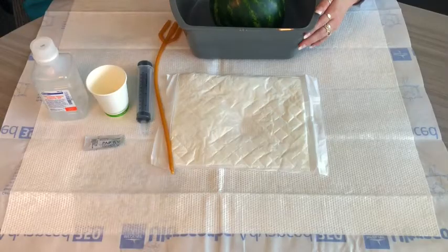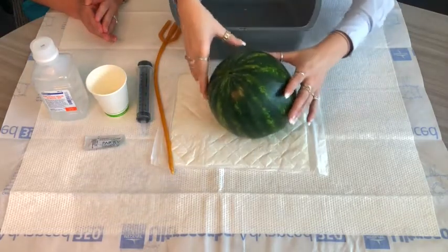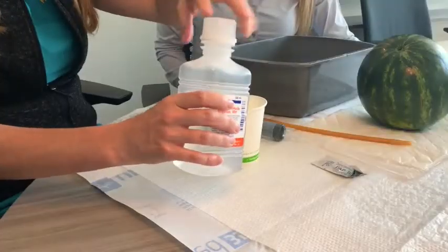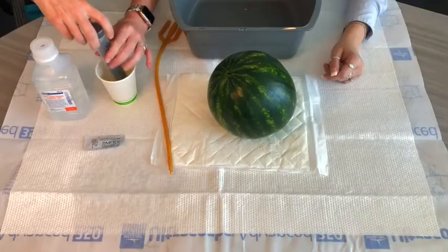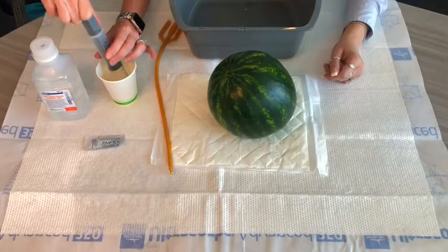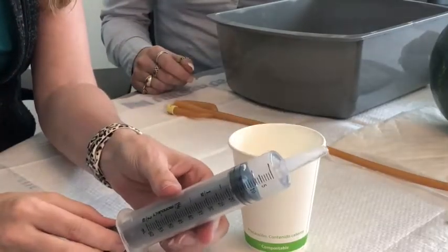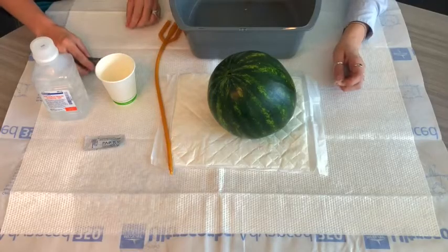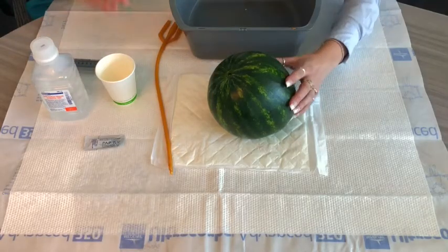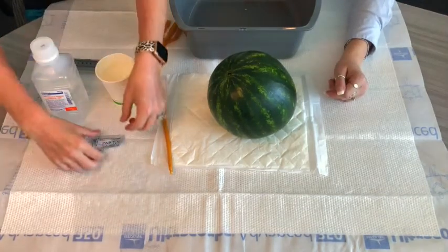First we're going to get our baby in position and set up our supplies. You'll want to draw up the saline that the doctor has ordered — the appropriate amount — using your syringe. You'll know you're at the right amount by seeing where it is on the hash mark of the syringe. Once you've done that, wash your hands and come back and open up your lubrication package.